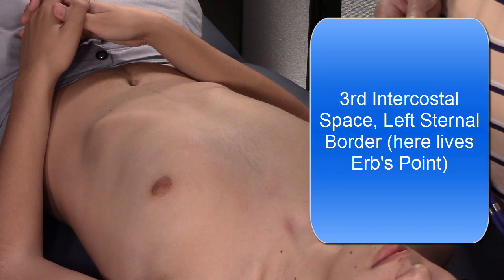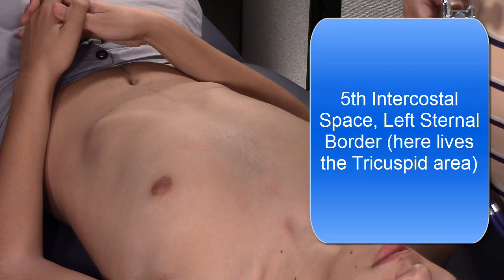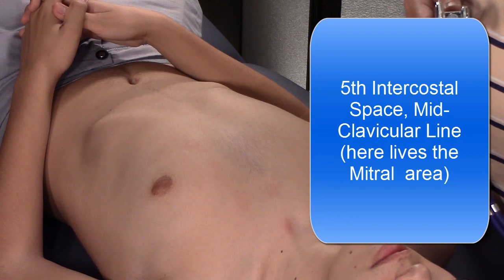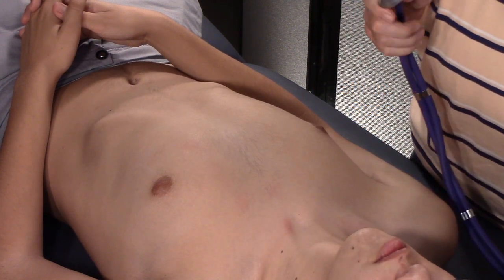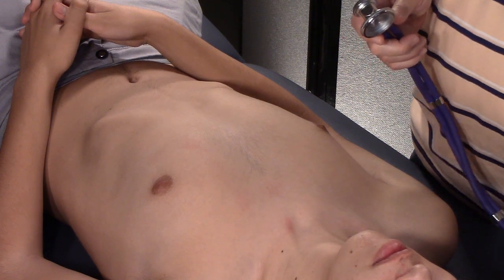The fifth intercostal space left sternal border is the tricuspid area where you hear the tricuspid valve. And the fifth intercostal space at the midclavicular line is the mitral valve. Let's see how we do it — first the real-world way I recommend, then for boards.